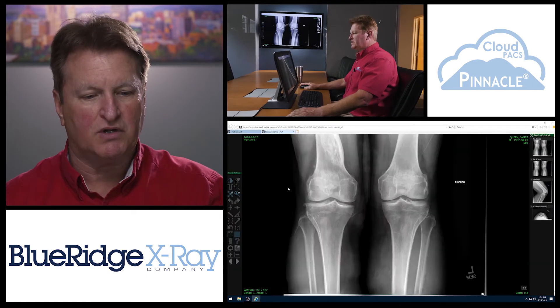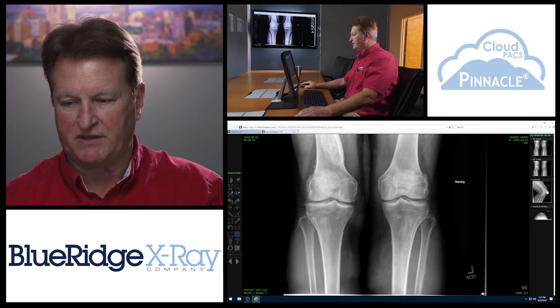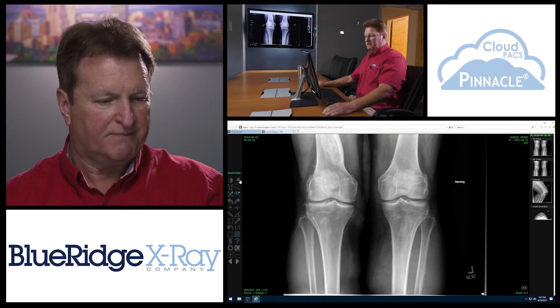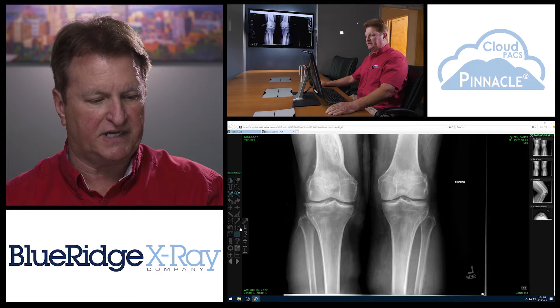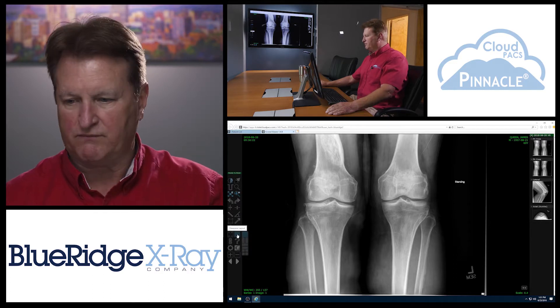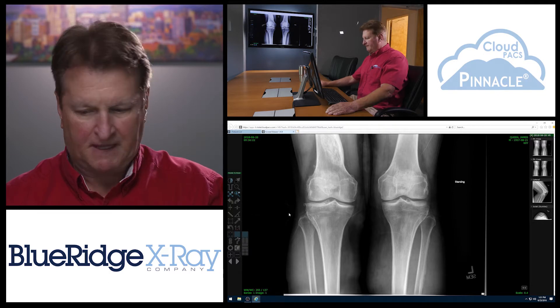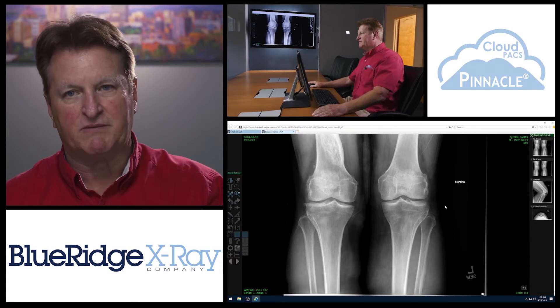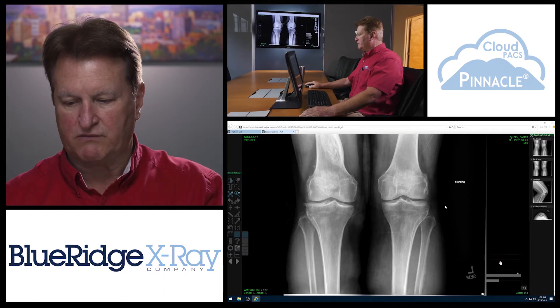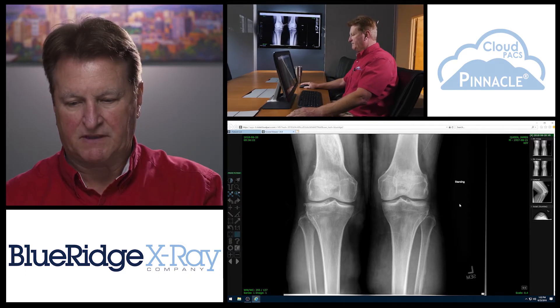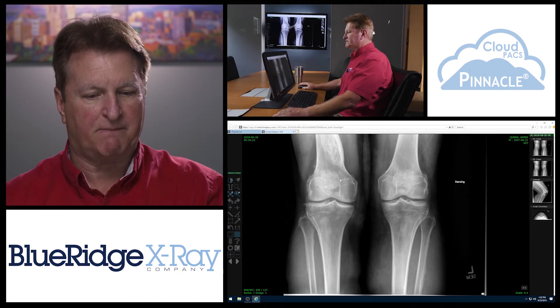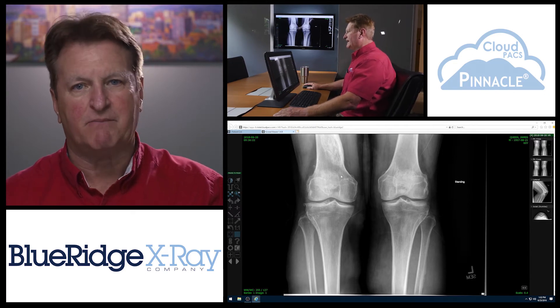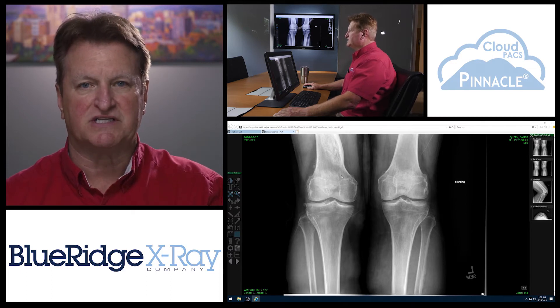To view images within the viewer, you click on any of the thumbnails. The thumbnails appear on the side and the top image is immediately available in the center screen. We have all of the tools available for flipping, measuring, and multiple panel viewing if you want to compare multiple views. All annotations can be saved as an additional image attached to the study, or you can remove any annotations. There is a reset button to return things to the original state. Mouse shortcuts are configurable for window and leveling, magnification, zoom, or any of the main features — and this is configurable per user.